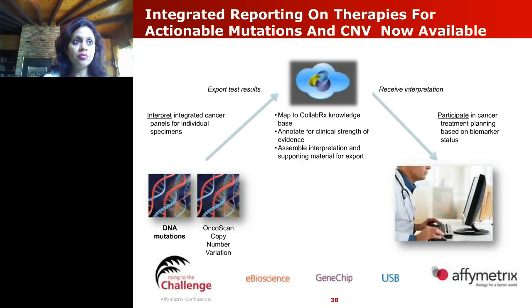So a typical output would say sample A, it will say % aberrant cells 60%, and then it will give you an integer copy number value of 6 that represents the copy number in the tumor portion only. So this, in our experience, has worked in about 80% of the samples.